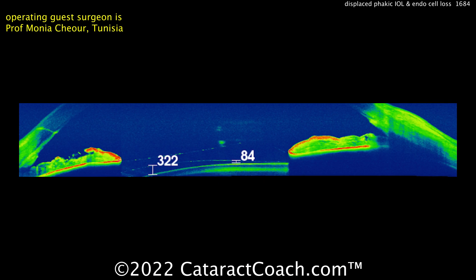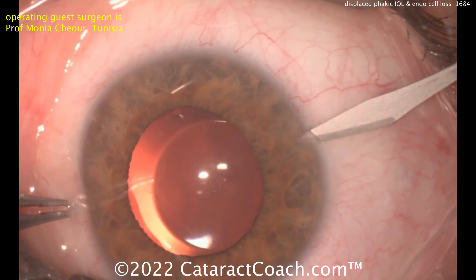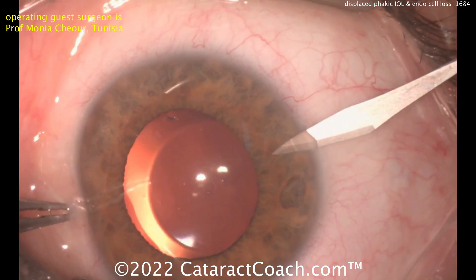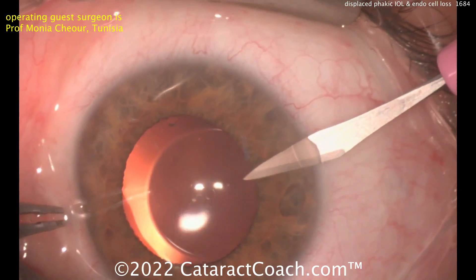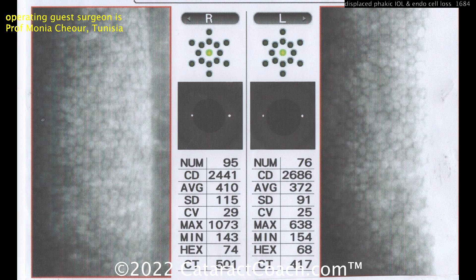Here's anterior segment imaging — you can see that as well. But let's slow things down for a second. Here's the preoperative examination of the patient. You can see both right and left eyes have a good endothelial cell count: 2,441 on the right, 2,686 on the left, so pretty even. That was one year prior.